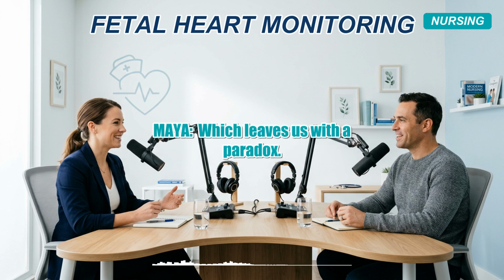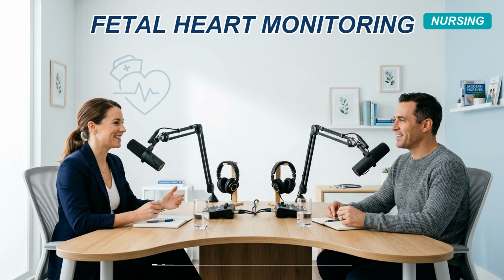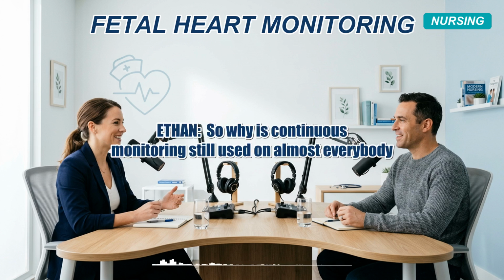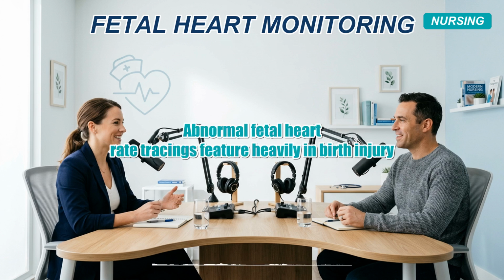Which leaves us with a paradox. ACOG explicitly states that intermittent auscultation, just listening in every so often, the old-fashioned way, is perfectly fine and evidence-supported for low-risk patients. So why is continuous monitoring still used on almost everybody who walks into a hospital in labor? Because obstetrics operates in a highly litigious environment. Abnormal fetal heart rate tracings feature heavily in birth injury lawsuits.